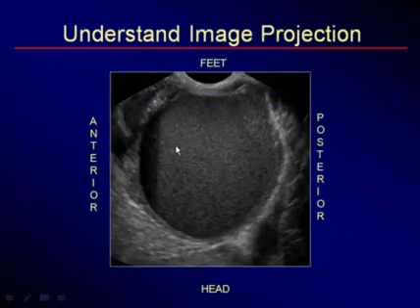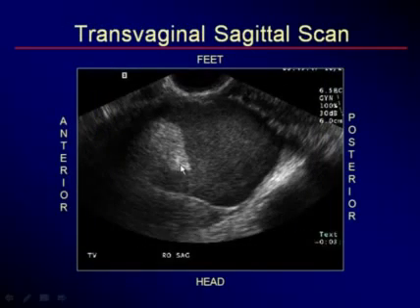And here's an adnexal mass, a sagittal image of an adnexal mass. We know this is anterior. We know this is posterior. Our level shows us that dependent material is to the posterior. And even though the level's up and down, we still know that's dependent. That helps solve complex cases like this one, where the echogenic material is on the non-dependent portion, which means it's floating. So now, once we make that decision, we know this is anterior, this is posterior, this is floating. Fat floats. We now have a 99% diagnosis of a dermoid.